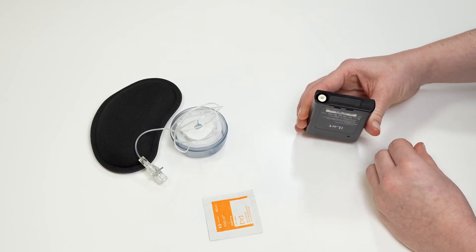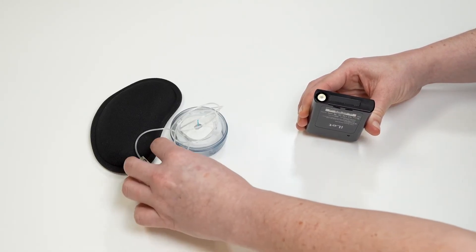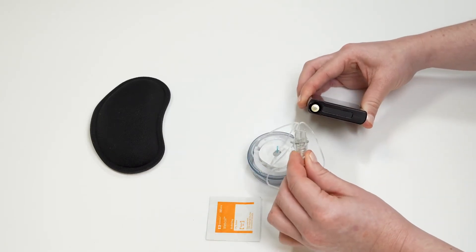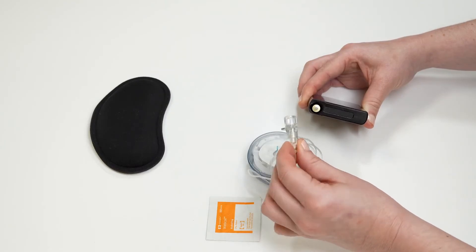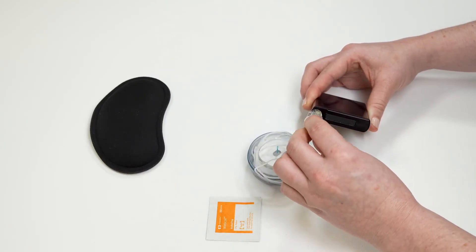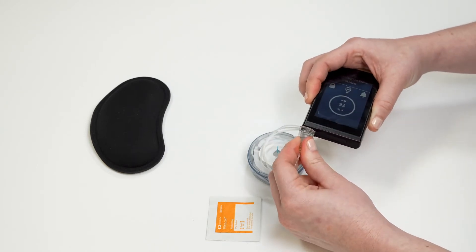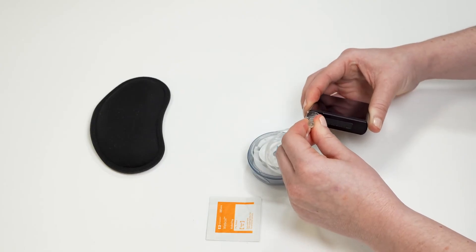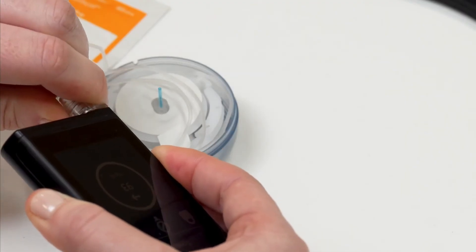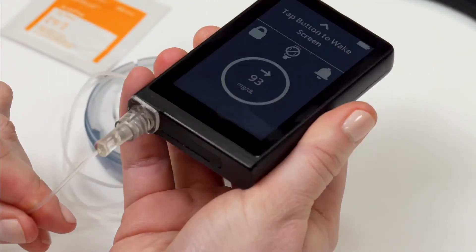Once the cartridge is inserted, insert the islet connect into the islet. Your islet connect has one flat side. Insert the islet connect with this flat side facing the outside of the islet. Push the islet connect all the way in so it is flat against the islet. Once it is all the way in, push and turn the islet connect a quarter turn to the right so the flat side is now flush with the front screen of the islet.